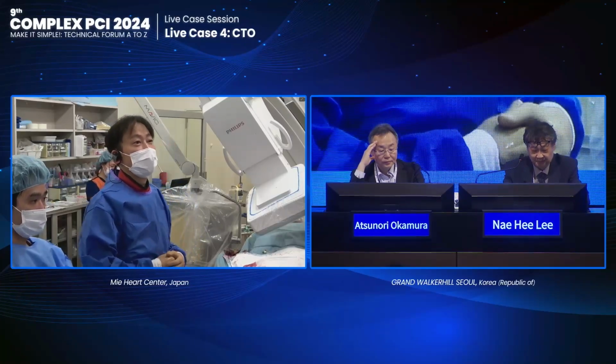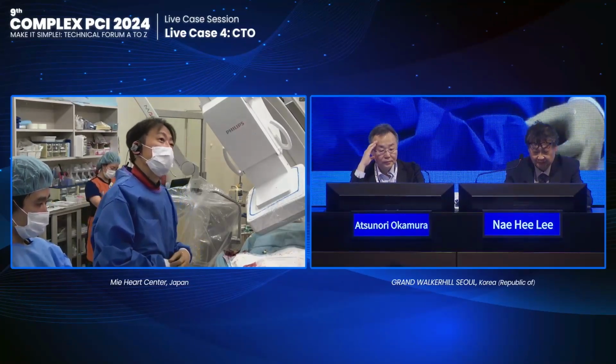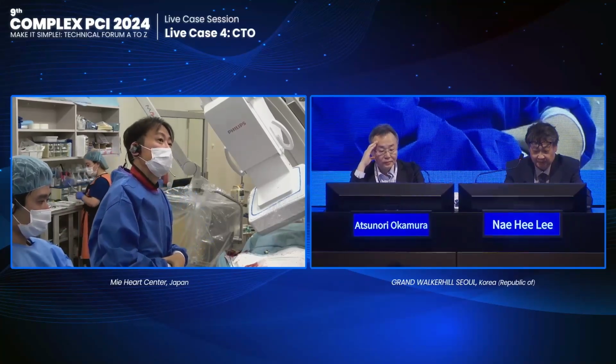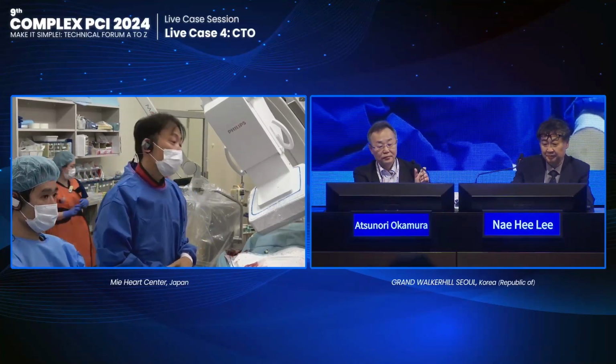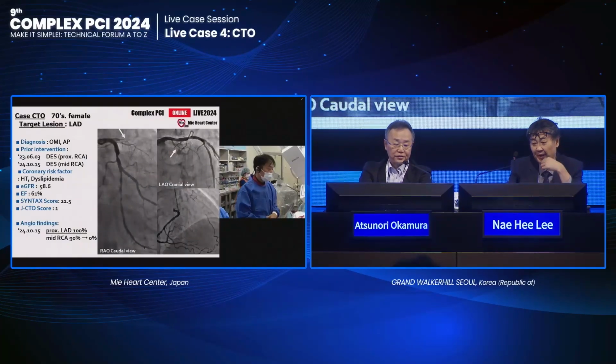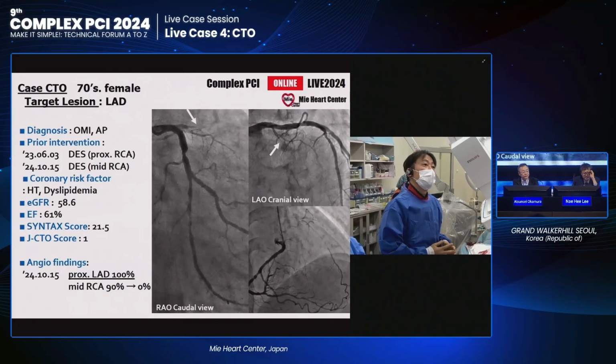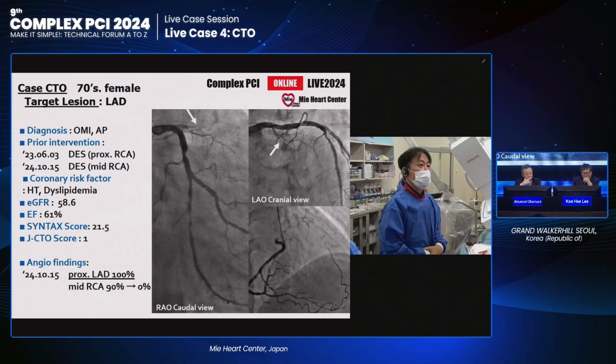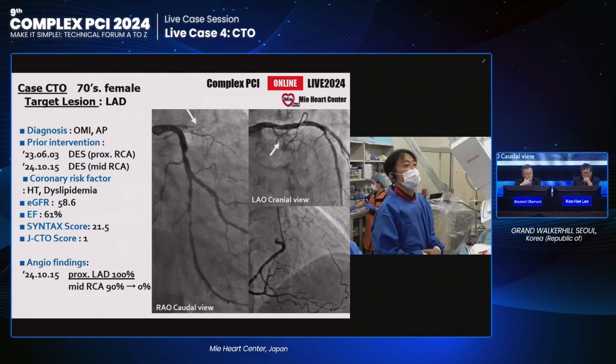Good afternoon, everyone. Thank you very much for the invitation to the complex PCI live demonstration this year. Our case is a female in her 70s, with a target region at the LAD. She had angina pectoris post myocardial infarction. She received a drug-eluting stent in the right coronary artery in June and October.